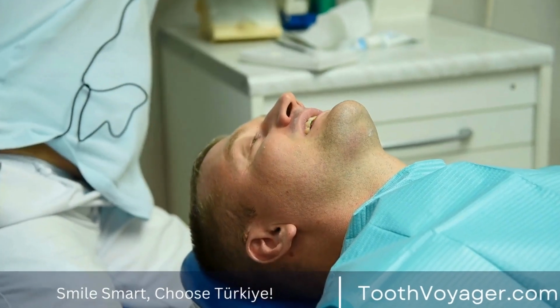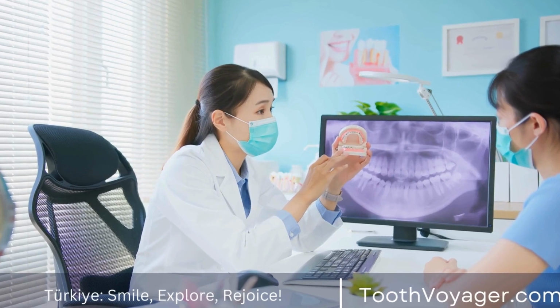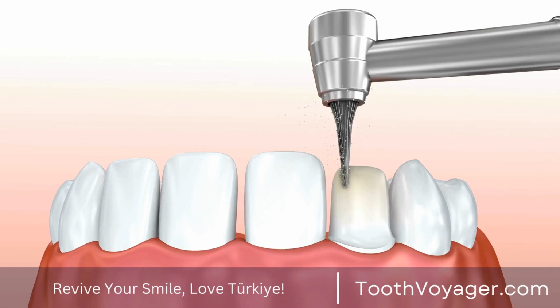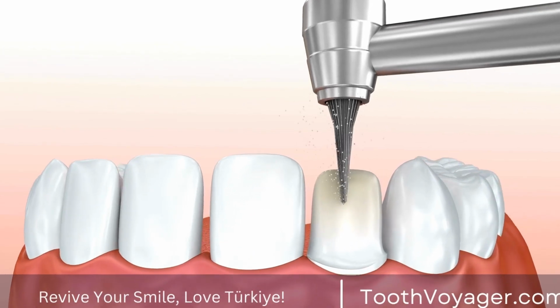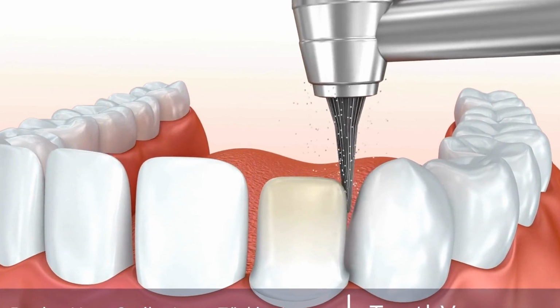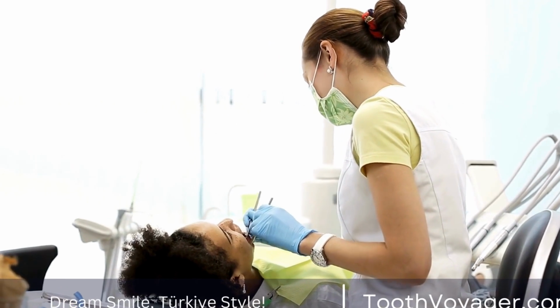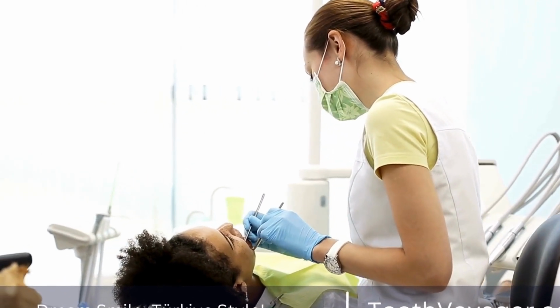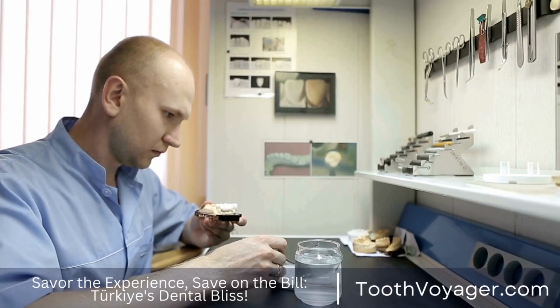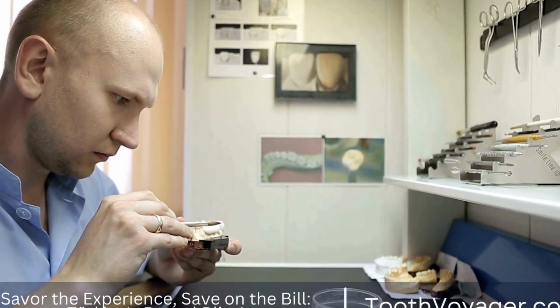1. Endosteal implants. Endosteal implants are among the most popular kinds of dental implants used at present. Implants are placed surgically directly in the jawbone, which provides a sturdy and solid base for the artificial teeth. Endosteal implants are usually constructed of titanium, which is biocompatible and fuses with the bone, creating an incredibly secure connection. This kind of implant is suitable for those who have enough bone mass to hold the implant.